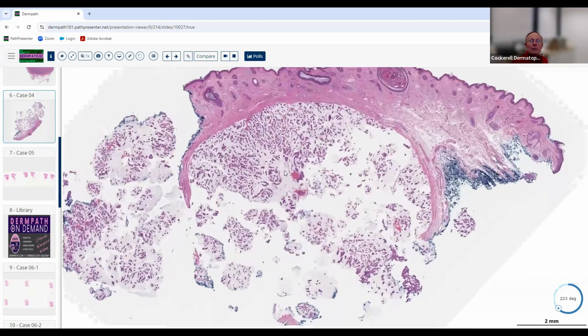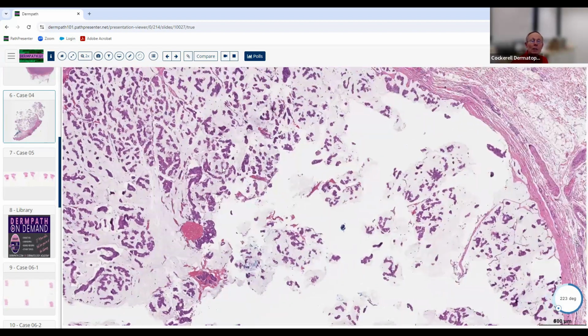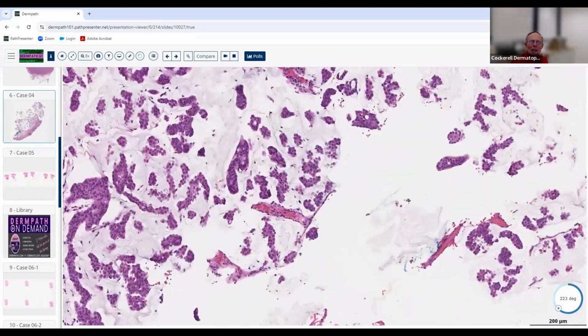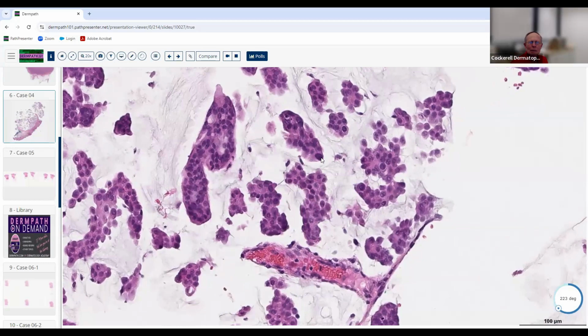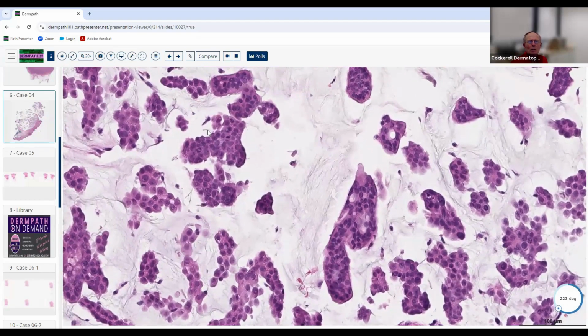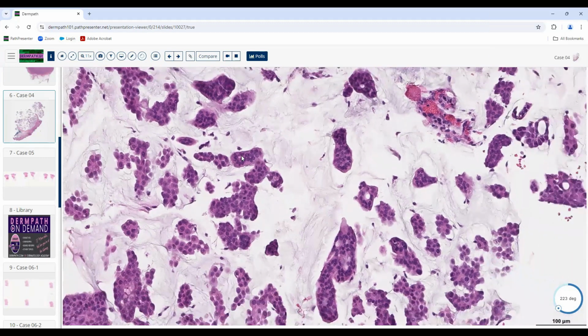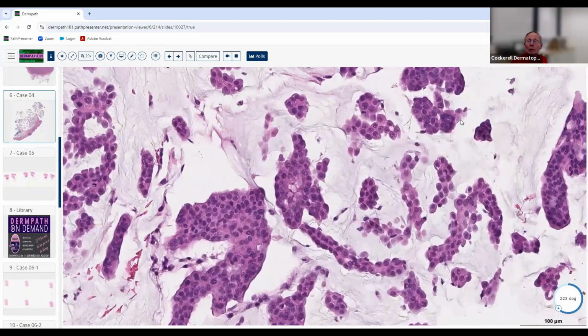Now we're going to higher magnification. And this lesion is kind of interesting because when you look at the individual cells, you may not see that many pleomorphic, bizarre cells or mitoses. Yeah, it's just some mild pleomorphism there, but nothing significant. Minimal, isn't it? Here's maybe a large nucleus and a couple up here, but very few mitotic figures. Fewer mitoses here than in the pilomatricoma, which was totally different. And I don't know if you would consider them a little bit enlarged or not, but some of the cells are enlarged. I totally agree.